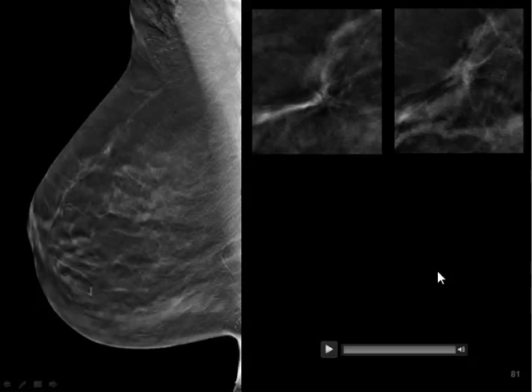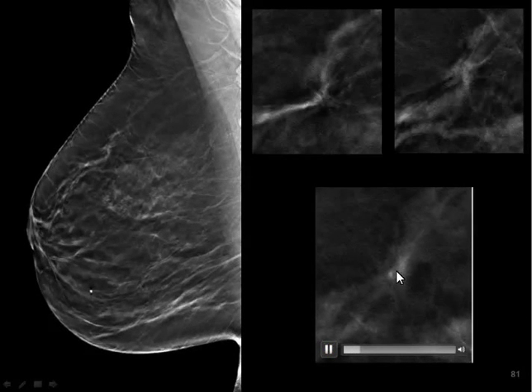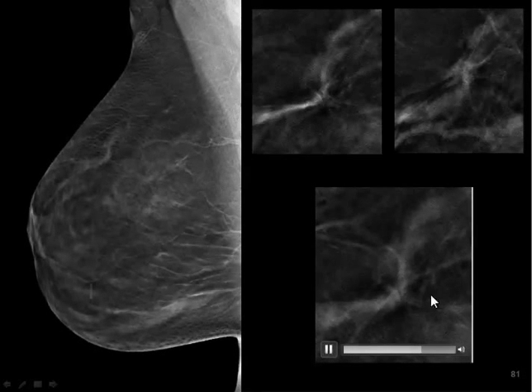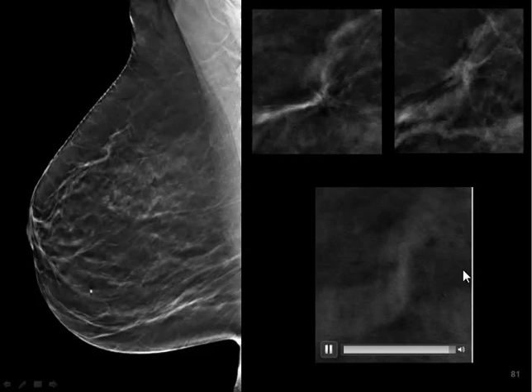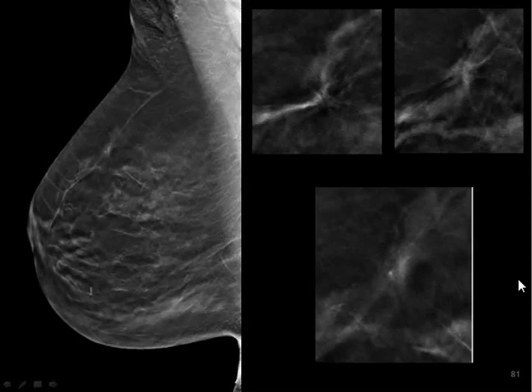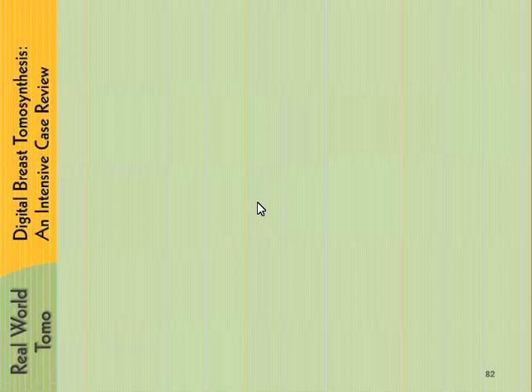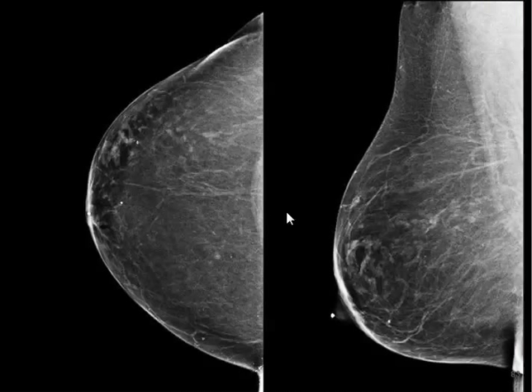On the MLO view, here's one lesion, and as we page through, we're going to see the second set of lesions. This was a multifocal infiltrating lobular cancer, and each of these lesions was less than 5 millimeters in size. Interestingly, most of the tumors we're finding on tomosynthesis are invasive tumors — the ones we don't see on 2D. The vast majority are invasive, and they're of all types: high grade, low grade, infiltrating lobular, different types.